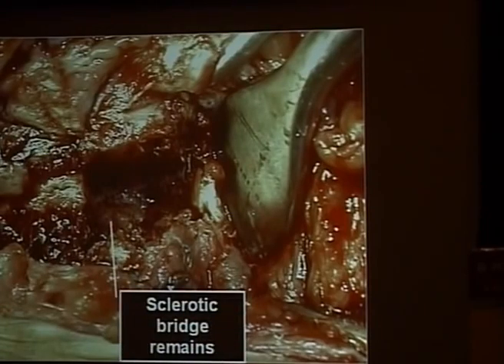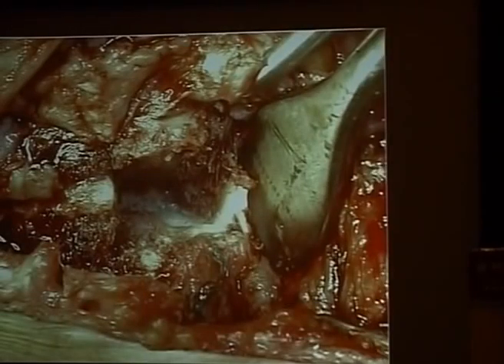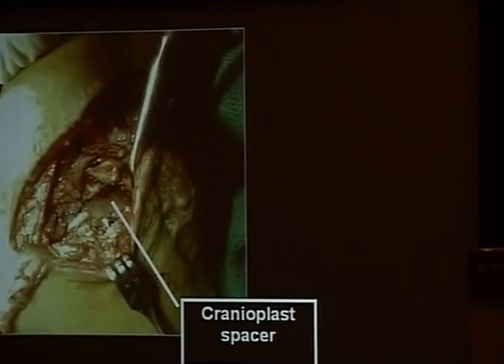So this isn't complete yet. There's still some sclerotic bone. Going a little bit deeper, now we're getting into the gray area of the physis. You can see the gray physis is now visible. And now we've got the physis completely freed up, sticking out in a little bit of profile, and that's going to decrease the ability of a new bridge forming across this as you put in your interpositional material.